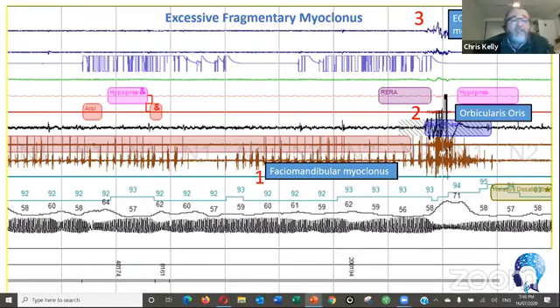So they're not actually tooth grinding or gnashing. But look at that frequency. Look at the consistency of the frequency. Now, in hindsight, I've inaccurately marked that. I must have got a bit lazy, because there's actually two series there of FMM, which is faciomandibular myoclonus.